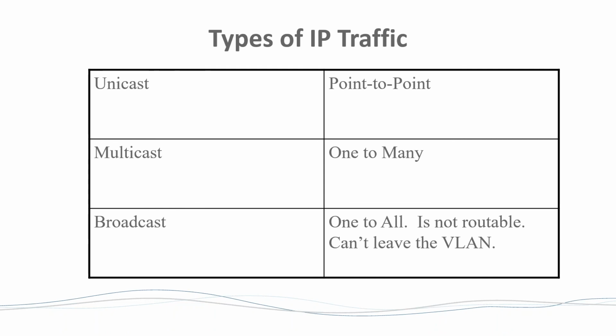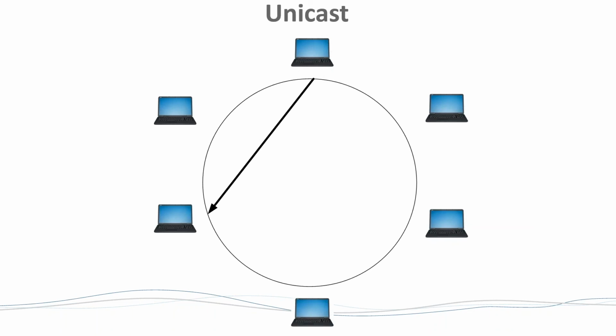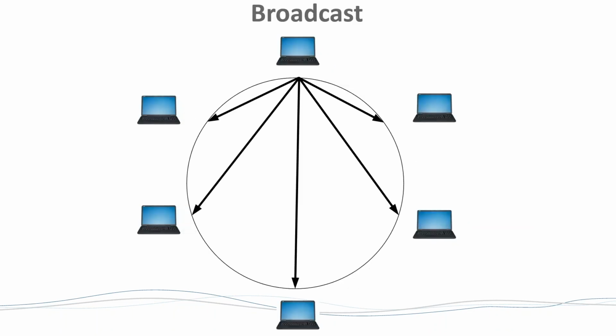Broadcast, you could think of, where do broadcasts come from? A radio tower, right? Or a TV tower. If you want to watch Channel 4, what do you do? You turn your TV to Channel 4, and you get the content on Channel 4. That's what multicast, no, I got it backwards, sorry. That's multicast. Broadcast is everything. We talked about that. I don't know why I was backwards on that. Multicast is the one-to-many, where there's one guy and there are a bunch of people looking at the same feed.